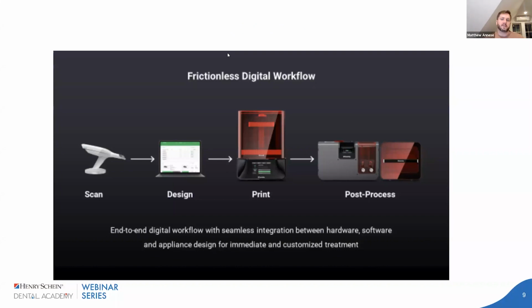And like I said, with the evolution, when you buy the printer, it doesn't just print itself. You can't just scan, print. There's the most important component, the CAD component that we're going to touch on. The design. How does it take your STL or PLY or OBJ files, and how does it get to the printer? Is there something intuitive that's built into the ecosystem?